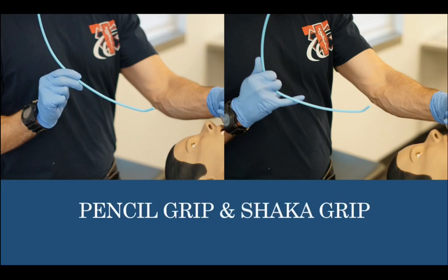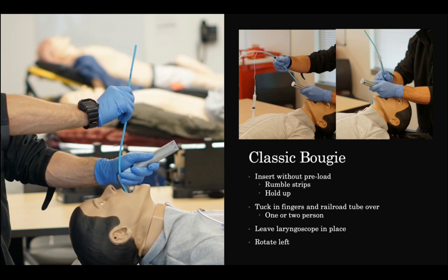There are a few ways that we can hold our bougie. We can use a standard pencil grip, or we can use what's called a shaka grip. We'll talk about these two things in the breakout sessions and give practice. So the standard classic bougie technique is: I perform laryngoscopy, get the best view that I can, and insert the bougie as I would an ET tube, but I keep the laryngoscope in place.